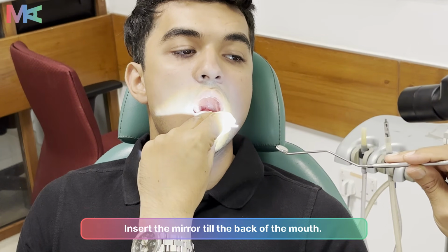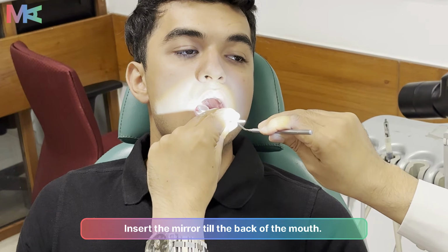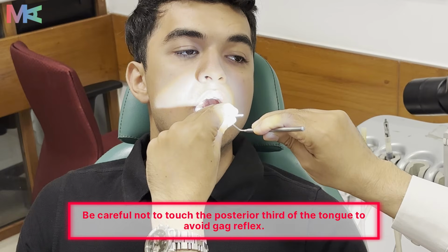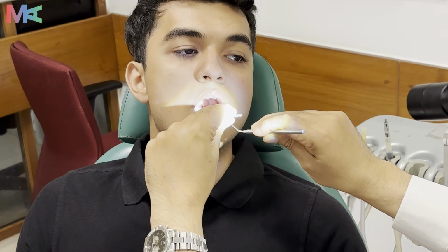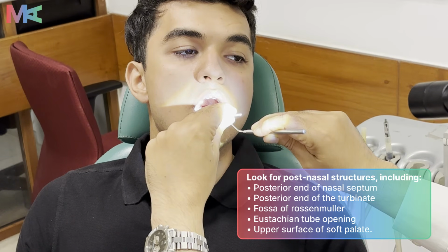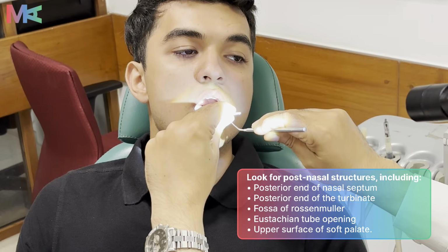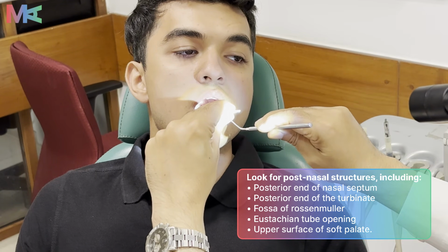So gently depress the tongue and then slide this mirror on this tongue depressor behind the soft palate. And once you are there, you will be examining the posterior rhinoscopy. You will be examining the nasopharynx, the fossa of Rosenmuller on both sides, and any signs of nasopharyngeal growth or adenoids.